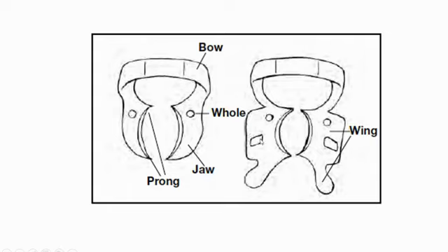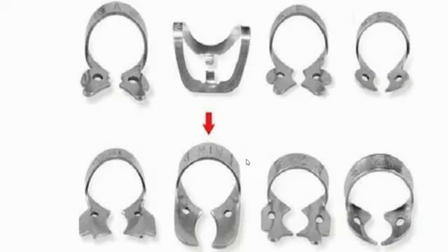ठीक है, इन विंगलेस क्योंकि वो बड़ा होता है तो होल्स डिस्टली भी है, मीजली भी है, और इसमें विंग्स नहीं है. ठीक है, दोनों को कैसे यूज करना है, स्टेप्स इन द स्टेप्स आई विल टेल यू. तो यू कैन सी फ्यू क्लैम्प्स, यू कैन सी द बो, यू कैन सी द विंग्स, यू कैन सी द होल, और मोस्ट ऑफ द क्लैम्प्स विल बी ऑफ दिस शेप.